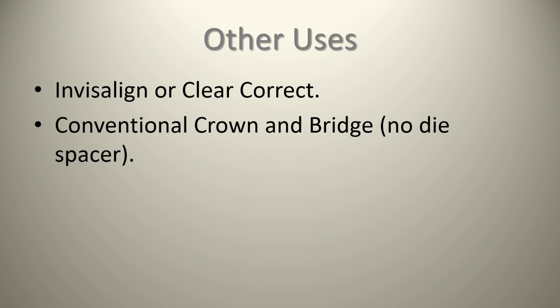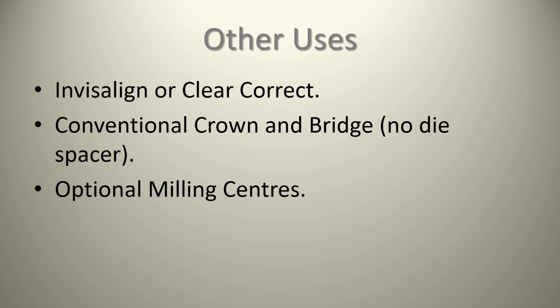There's some optional milling centers in which basically you have your staff creating crowns in the back room. Most of my experience with these milling centers is after 2 or 3 crowns, you got to clean these machines out. So like I said, it's not really saving you time. You still got to get your staff or somebody to go and do these things, and you still got to sit there and mark where the anatomy is and mark where the margins are. You still have to polish and glaze these things in your own office. So as opposed to having another operatory or a fancy sterilization center or a larger waiting room for your patients, you're utilizing a lot of room in your own office, expensive room, for basically operating a lab.